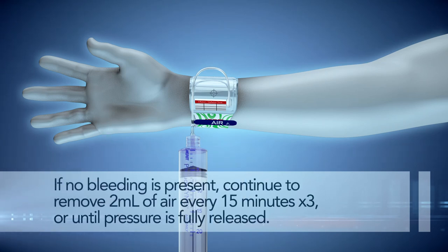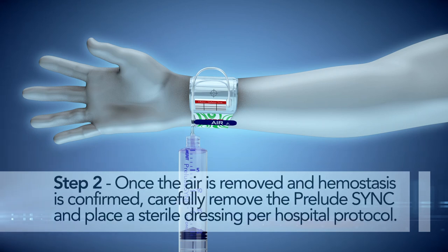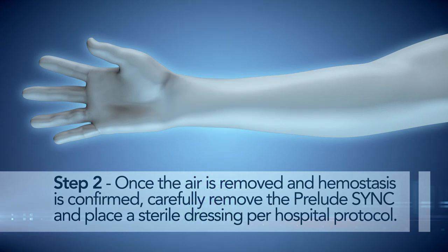If no bleeding is present, continue to remove 2 ml of air every 15 minutes, three times, or until pressure is fully released. Step 2: once the air is removed and hemostasis is confirmed, carefully remove the Prelude SYNC and place a sterile dressing per hospital protocol.